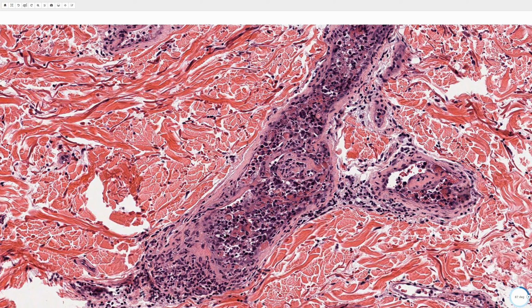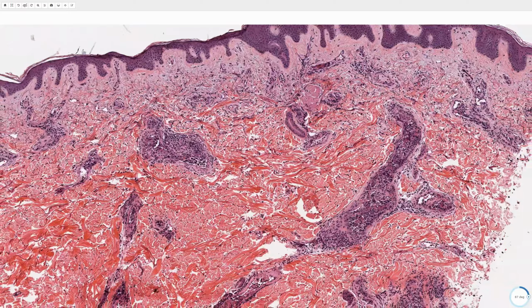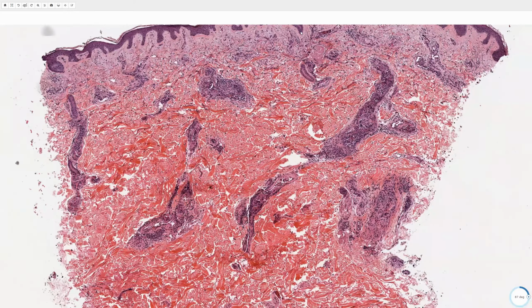And this is an unusual intravascular large B cell lymphoma that tends to spread with intravascular hematogenous spread. And these present as bruise-like lesions clinically. These are usually also positive for BCL2. And rarely may also express other markers, but this is a pretty unusual scenario that you might not see very often. So an example of an intravascular B cell lymphoma.